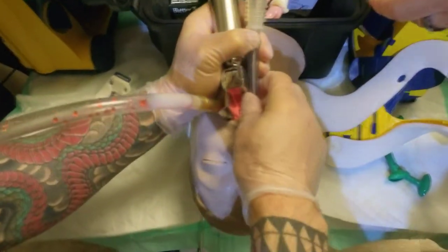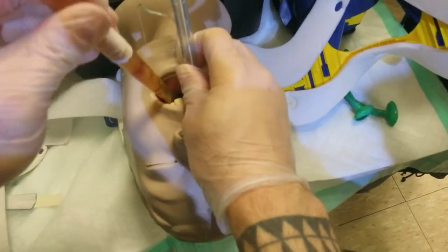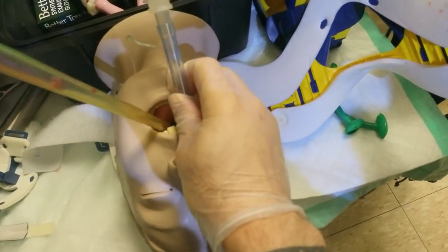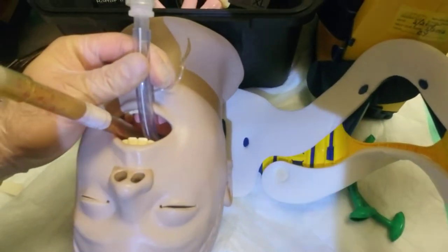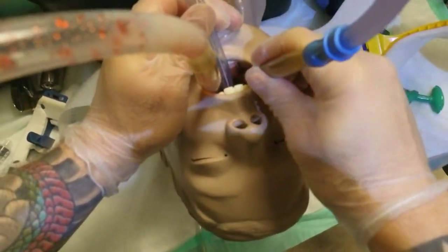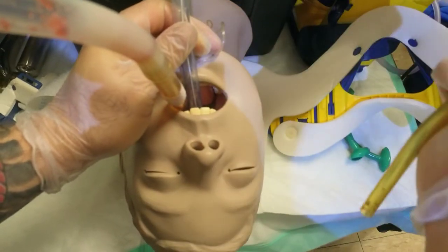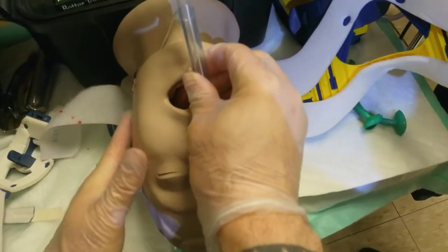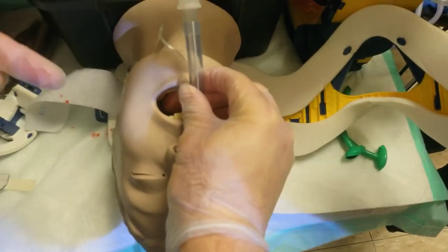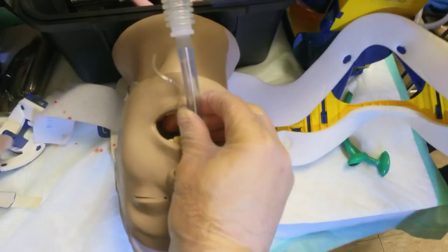Now that I have good confirmation, I take the blade out. I no longer need the suction parked in the esophagus — I can remove it. If I needed to suction while the tube was being placed and contamination was coming up, I could have used the second suction unit. Now I have two units available. If one fills up fully, put it to the side. We have decontaminated the airway. Now — what if I've secured the tube but blood and vomit are still coming out? Should I be worried? No. I have now secured my airway and can continue suctioning.